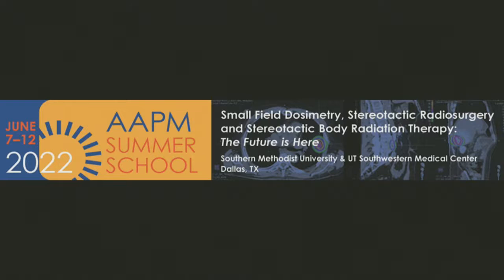Yeah, thank you. Very nice illustration, very comprehensive on the registration fusion. I have a question. I especially appreciate you outlined the 3-step registration: intensity-based, then point-based, and then contour-based. And I find a great application in our prostate SBRT cases, where we are increasingly escalating dose from PTV to boost dose to prostate, and then to the intraprostatic lesion inside prostate.